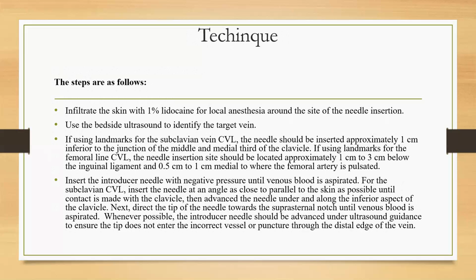Then advance the needle under and along the inferior aspect of the clavicle. Next, direct the tip of the needle towards the suprasternal notch until venous blood is aspirated.